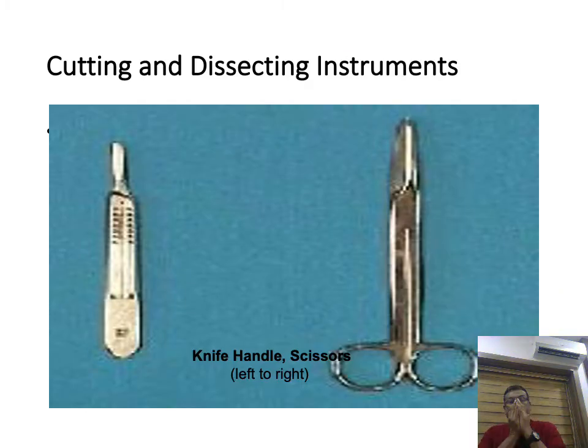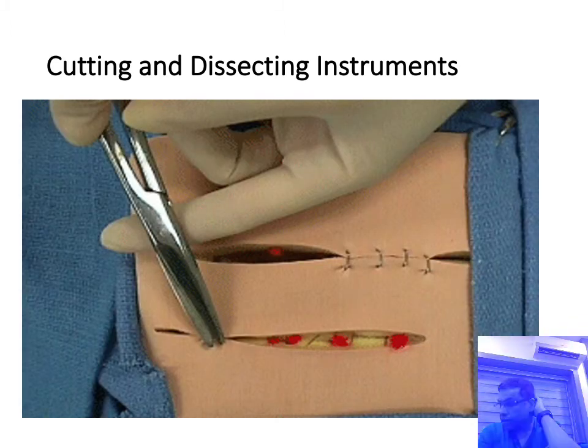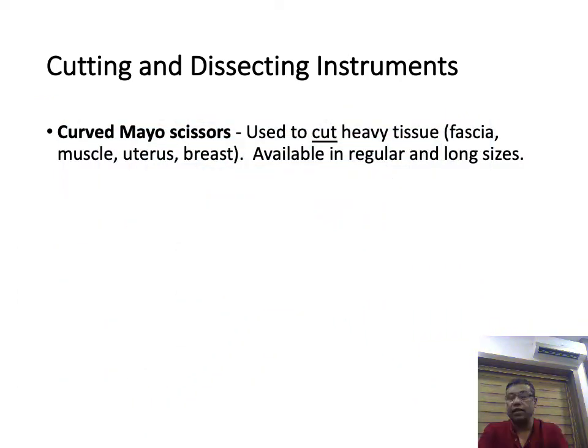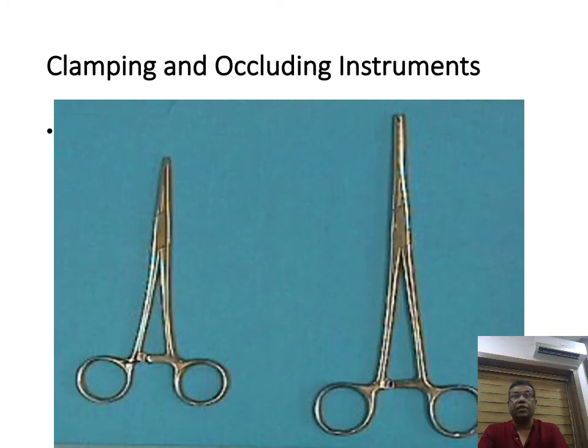Now coming to cutting and dissecting instruments. This is a cutting scissors with a flat blade used for cutting. That is a curved dissecting scissors called Mayo scissors. It can be used to cut fascia, muscle, uterus, and breast — these are dissecting scissors that can also cut tissues.